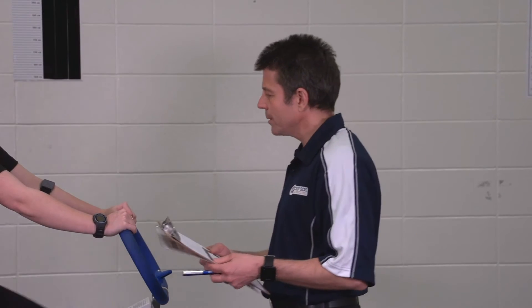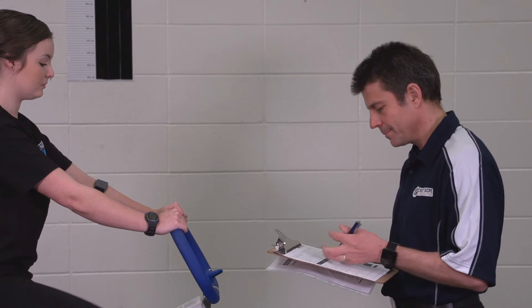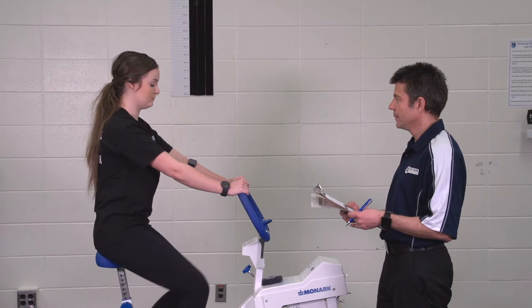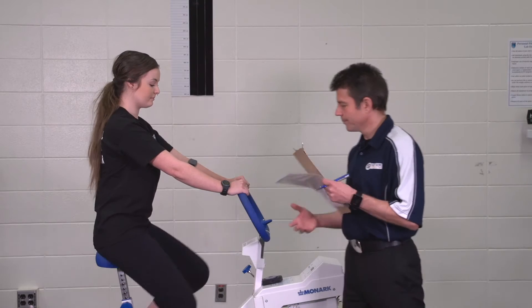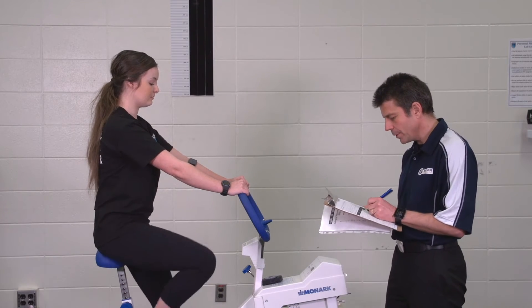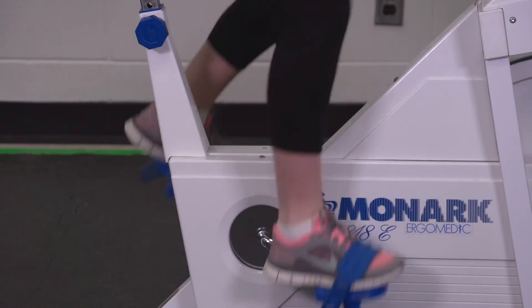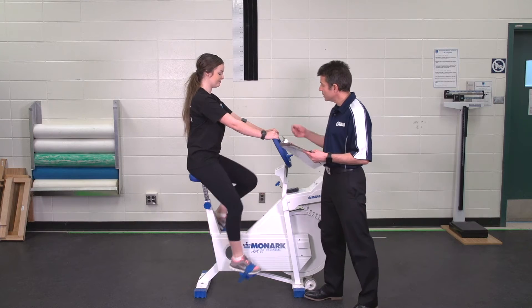Alara, we're at minute one, so I'm just going to check your heart rate. Okay Alara, we're at minute two — I'm going to check your heart rate again. Okay Alara, we're coming up on three minutes, so I'm just going to check your heart rate again.